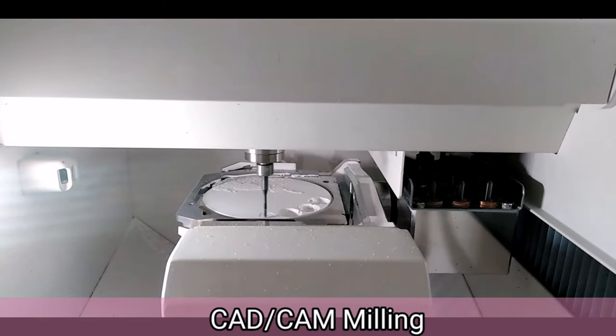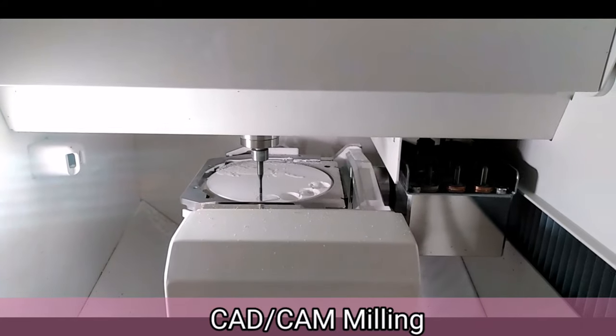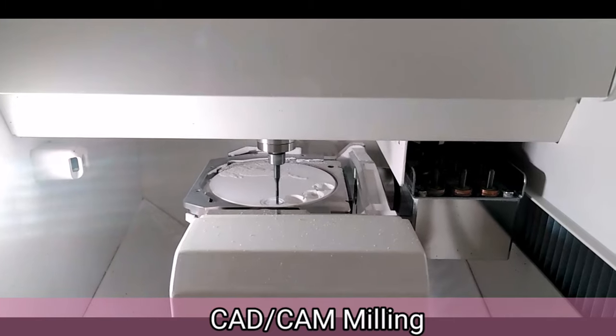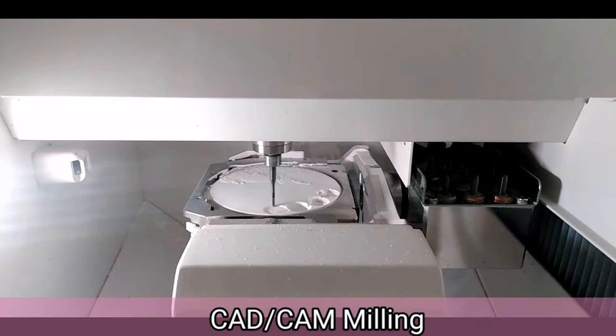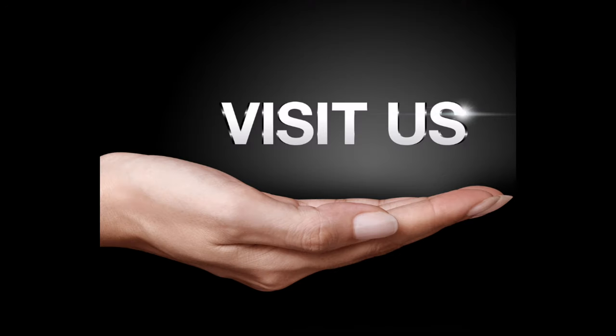We have a digital CAD-CAM milling machine which made our work easier and more efficient. I love it because it can work overtime and produce dental crowns faster while still rendering a high quality outcome. For patients with very limited time — whether you're busy, from the province, or abroad — we are able to provide your dental needs in a short span of time.